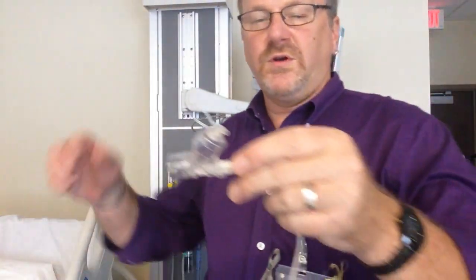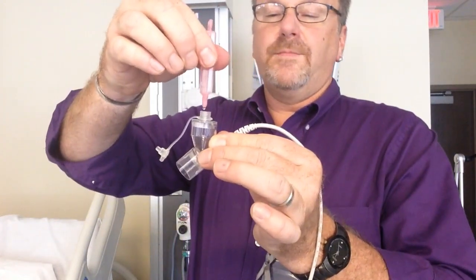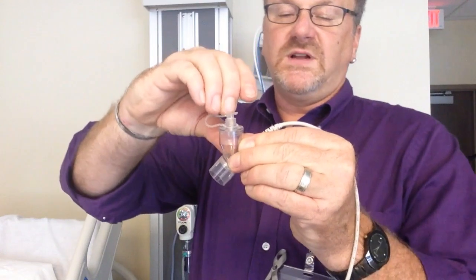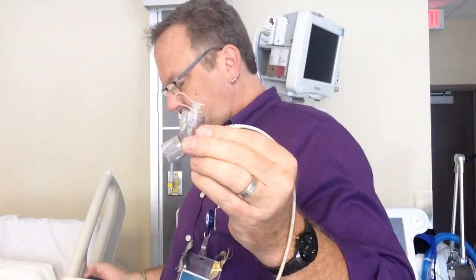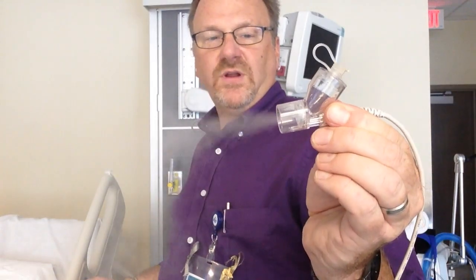Now I'm going to show you how to put the medication in. Drop by drop — I'm only going to put four drops in. Close it up, and then turn it on. That is it, and you're delivering medication.